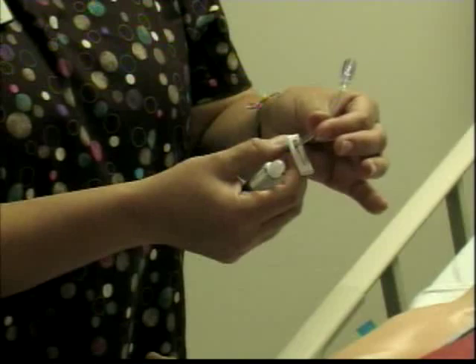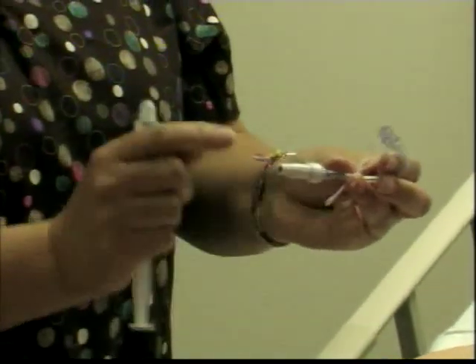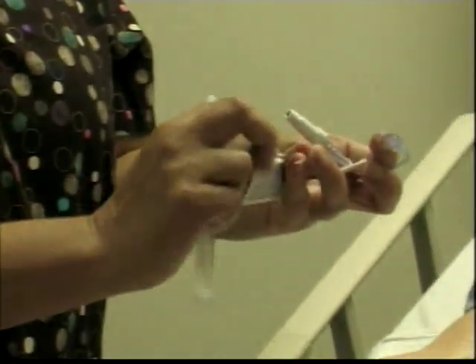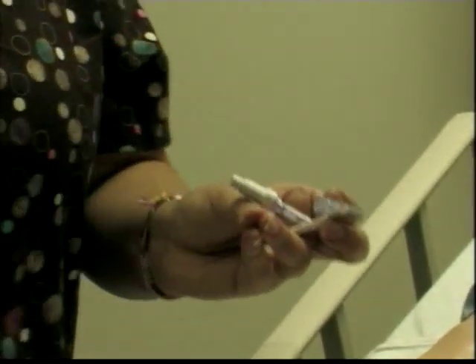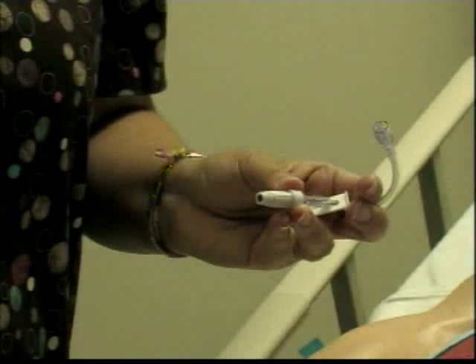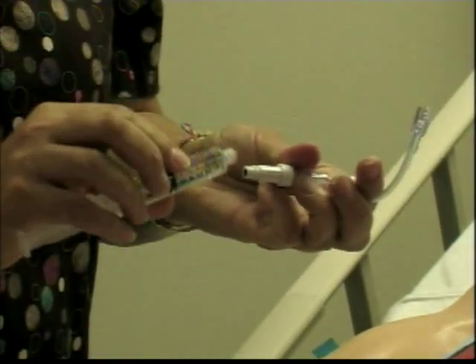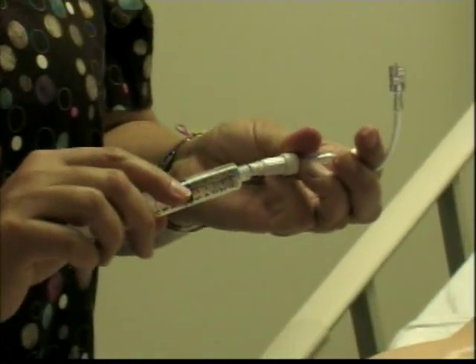Now, if you notice that when I did that, I actually touched that part right here with my hand. So I'm going to make sure that I clean it so it doesn't get contaminated again. I clean it. I will go ahead and remove the cap. I will connect, make sure that I get all the air bubbles out. I will connect.